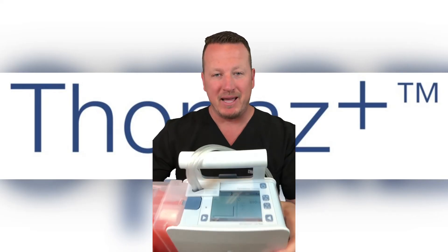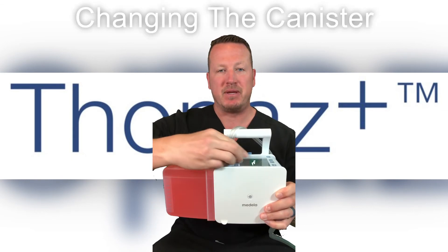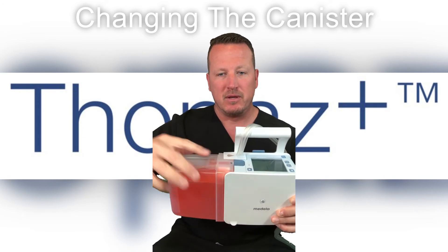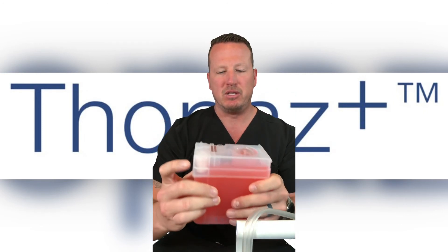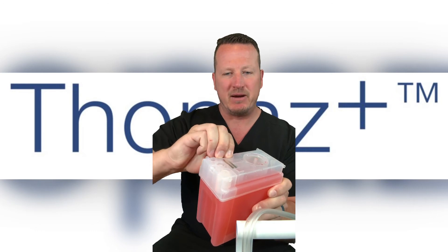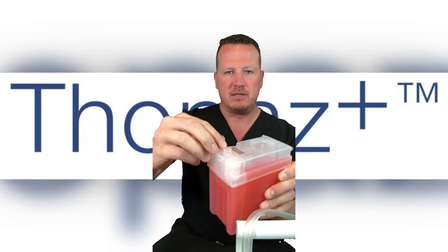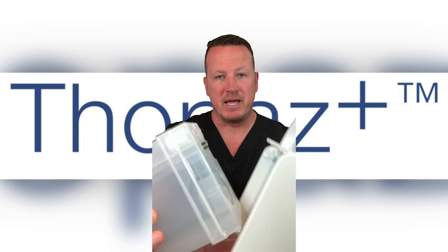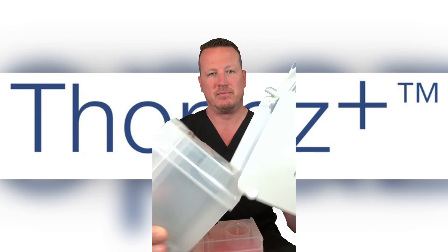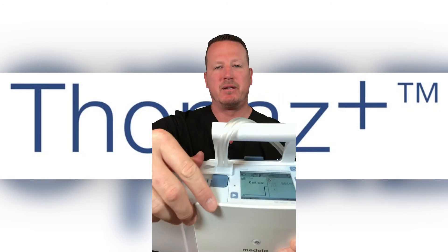When in standby, change the canister by clamping the Topaz tubing. Press the big blue release button to release the canister. Seal the used canister by tearing off the canister seals from the back of the canister and inserting them into the holes. Replace the canister, press On, and unclamp the tubing.